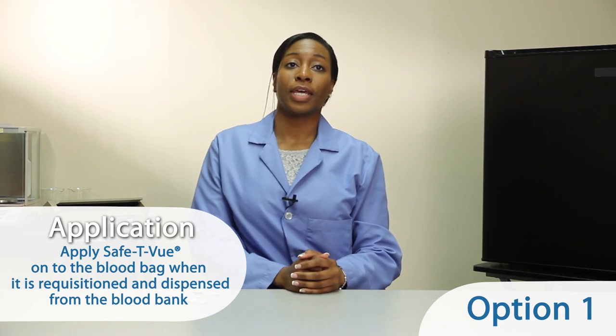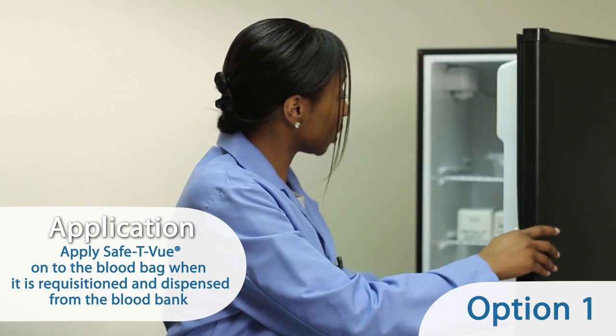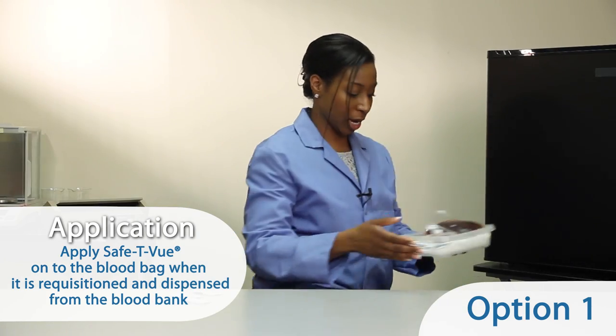You have two options of when to apply the safety view onto the blood bags. One option is to apply safety view immediately onto the blood bag when it is requisitioned and dispensed from the blood bank.